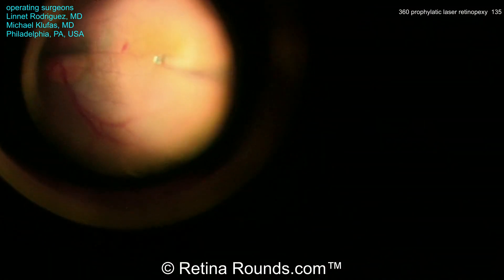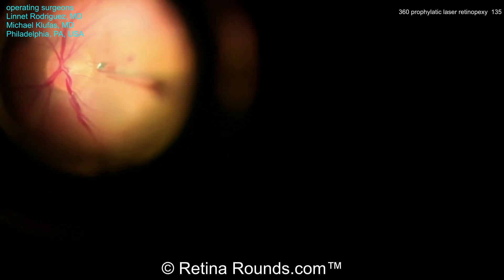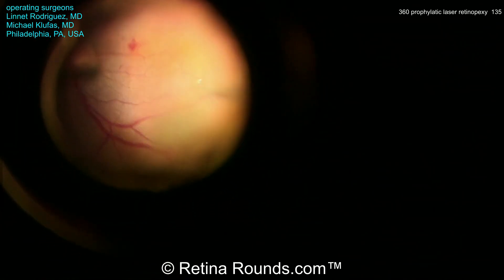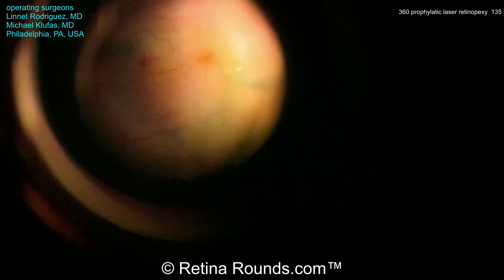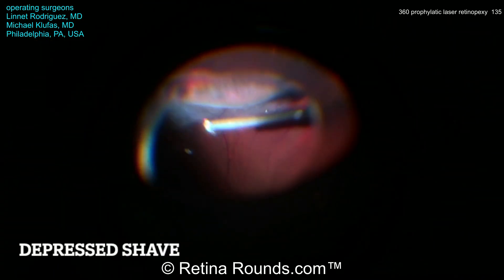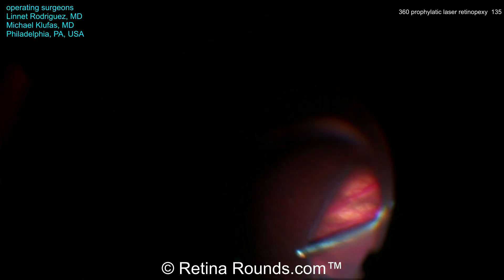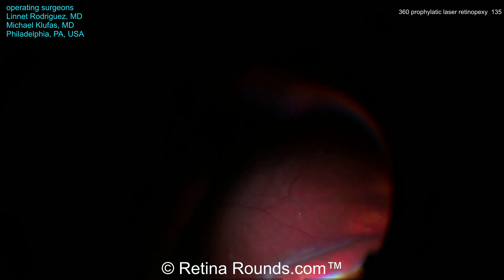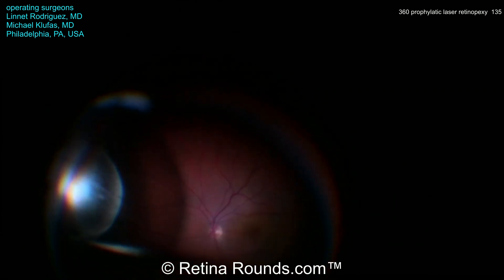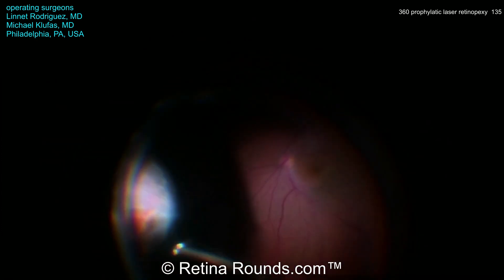Here's some additional ICG being used to stain the residual ILM and to better see the edge of the epiretinal membrane, and now that epiretinal membrane peeling has been completed — a very nice and efficient peel. Some additional peeling is being performed to extend that over the temporal macula. Dr. Klufas and his fellow are now going to perform a peripheral shave, with scleral depression being used to trim the vitreous back.